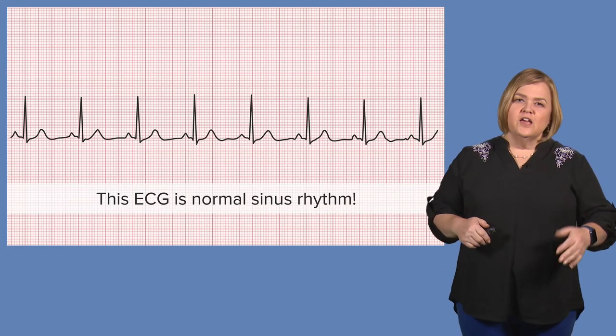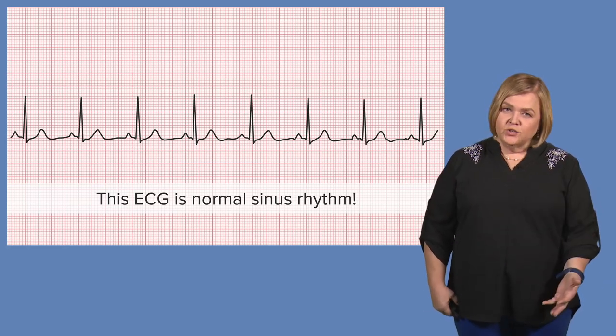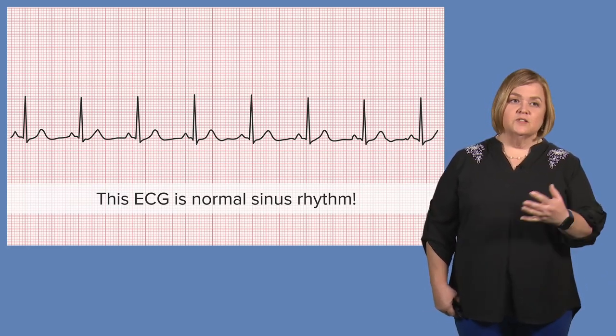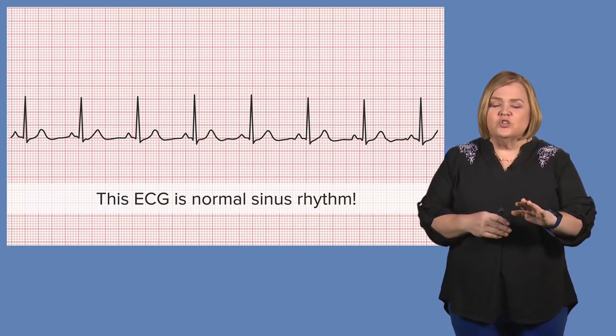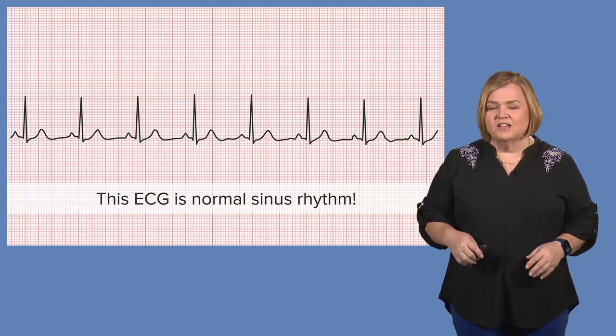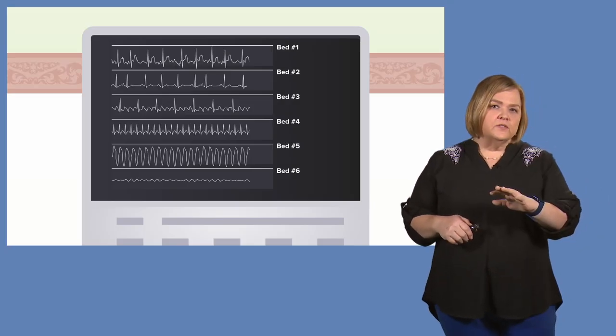So here's our friend, Normal Sinus Rhythm. By this point, you might be saying, why do you show us this every single time? Well, hey, I hope you're getting bored with this because that means you have learned how to recognize normal sinus rhythm. Now we're back with our patients.